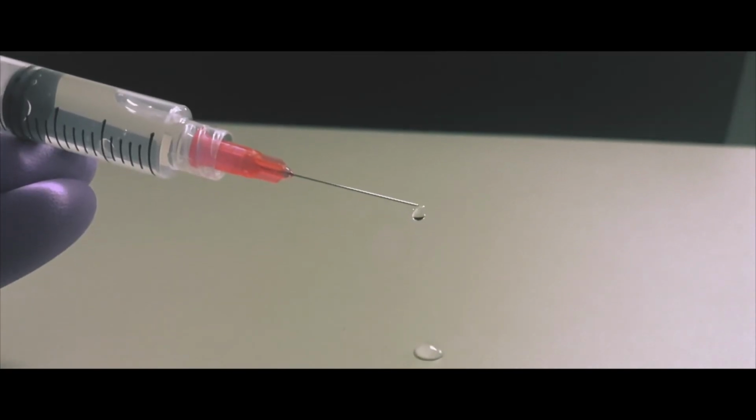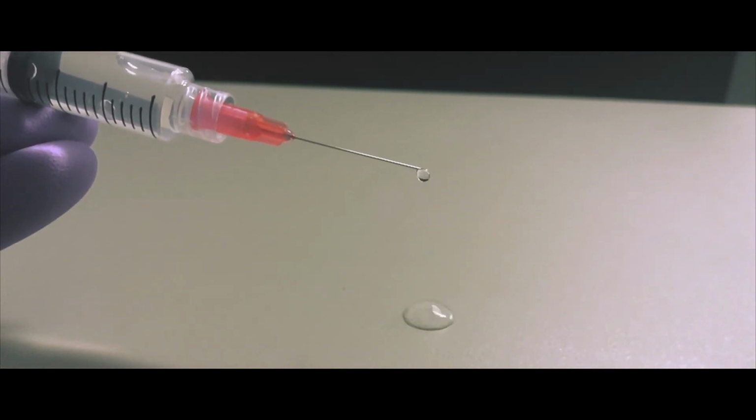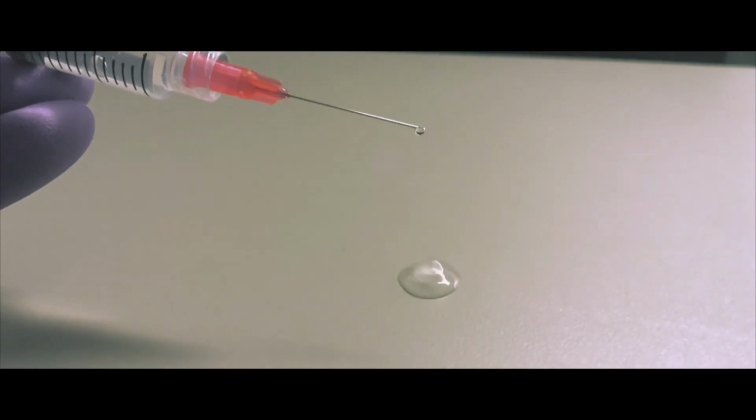So no matter if you're using hand instrumentation or if you're using rotary files for your root canals, you really should ensure that you're trying to get your irrigation to that working length. And be sure to use a side vented irrigation needle because it's really a lot safer than a needle that expresses sodium hypochlorite out the tip, because the side vented actually shoots it out the side, so it's less likely to go out into the apical tissues. And it's also less likely to cause sodium hypochlorite injury.